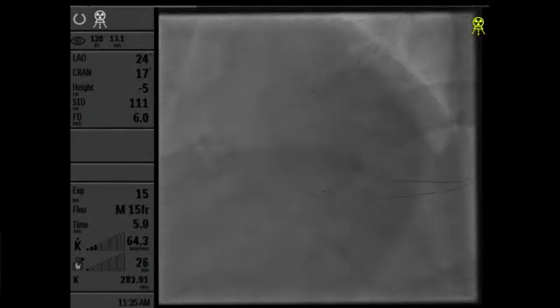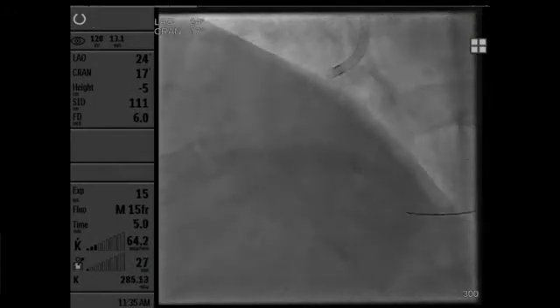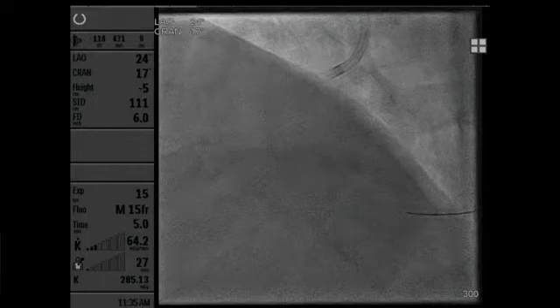Was the proximal part of that stent well opposed? Yeah, it was greatly opposed. Yes, we saw it by OCT. I thought there was an edge actually, but yeah, start with that and you'll be able to go.